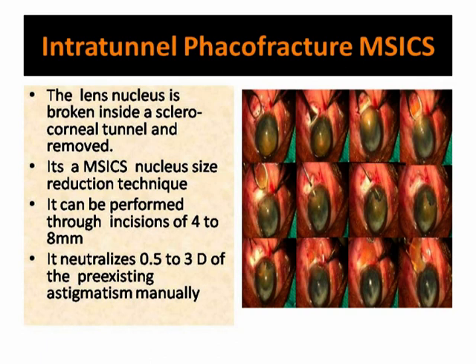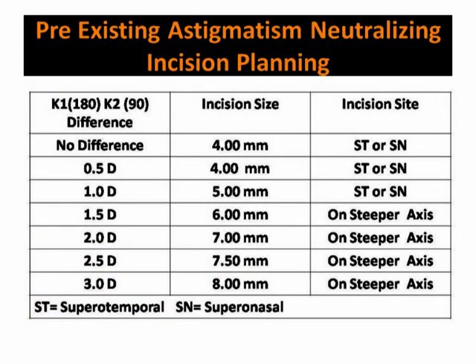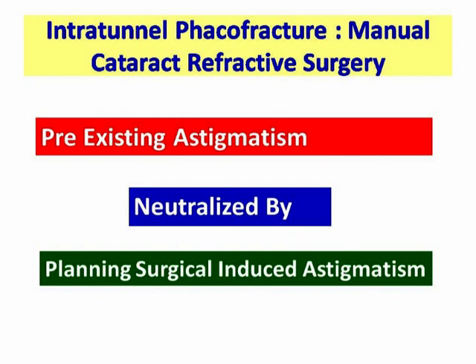Intratunnel FACO fracture is a nucleus management technique of manual small incision cataract surgery, in which the lens nucleus is broken inside a sclerocorneal tunnel and removed. It can be performed through an incision of 4 mm to 8 mm. Up to 3 diopters of pre-existing astigmatism can be effectively neutralized by planning the incision size and site, eliminating the need for expensive toric IOLs. In other words, neutralizing pre-existing astigmatism by MSICS-induced astigmatism is also a cataract refractive procedure.